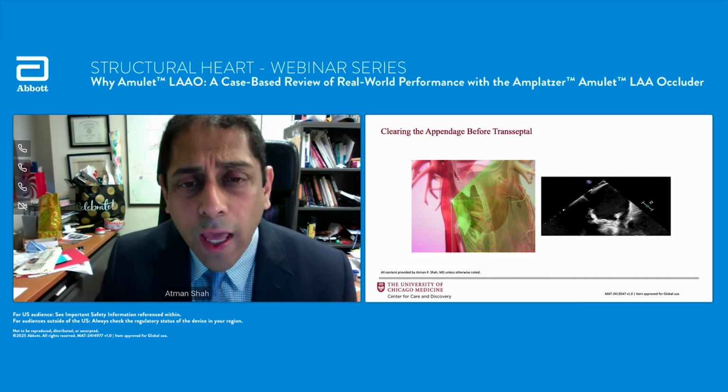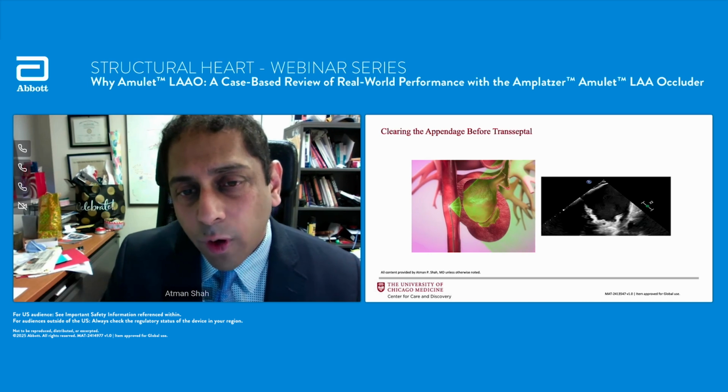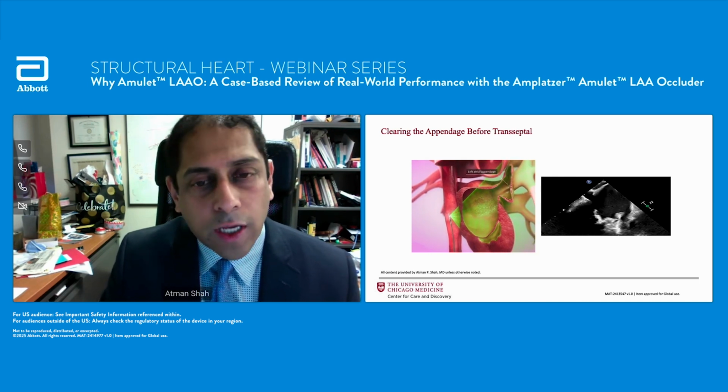We'll go ahead and clear the appendage with ICE beforehand, making sure there's no clot. We'll also do a nice effusion check.